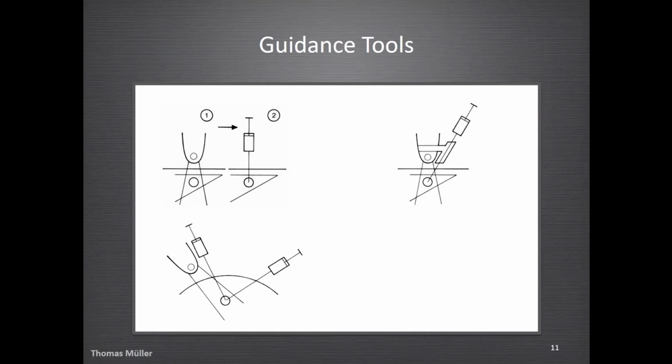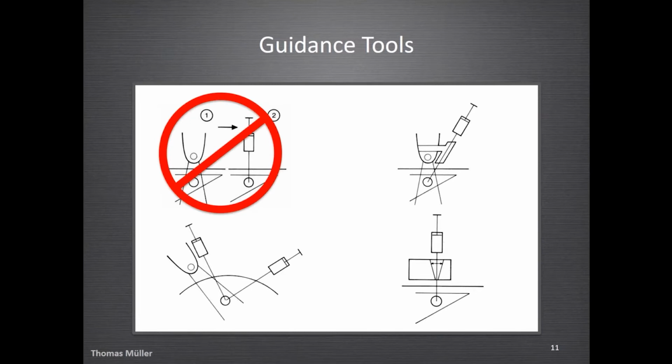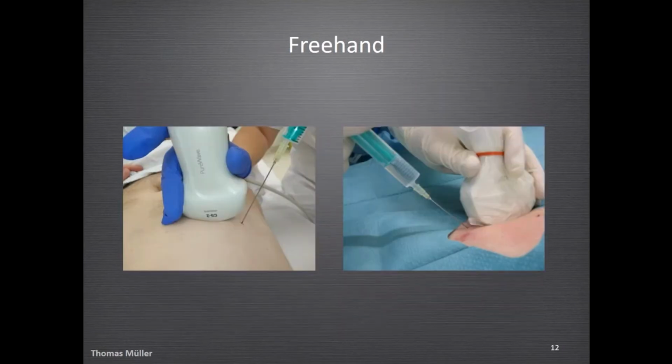We have applicators that can be fixed to the transducer, to the probe, and of course we have dedicated puncture probes. We are not talking about that I do ultrasound and I put away the probe and do some puncture. No, we are talking about ultrasound guidance. And here I would first of all recommend the freehand technique.